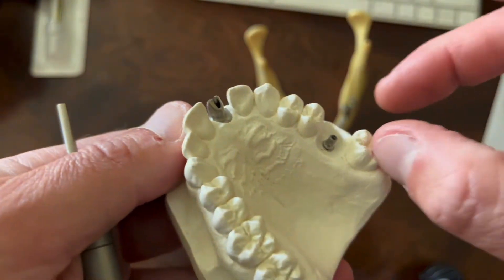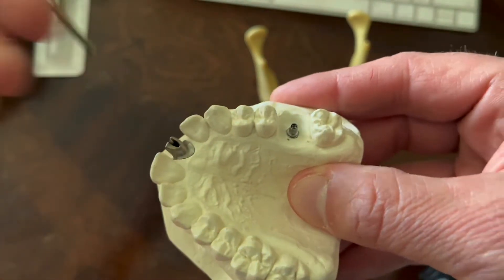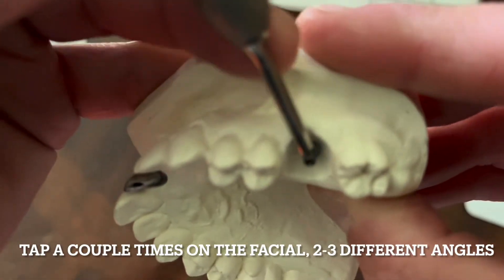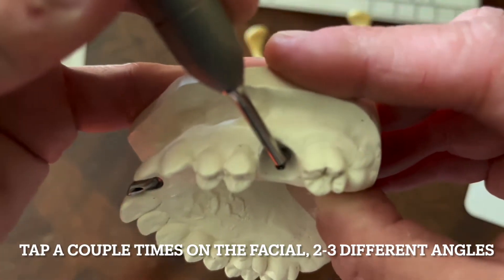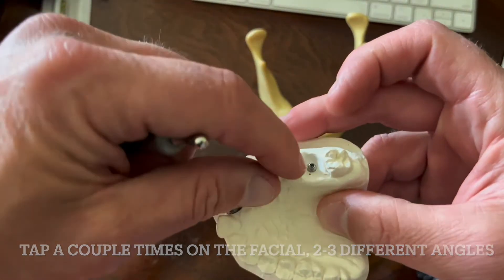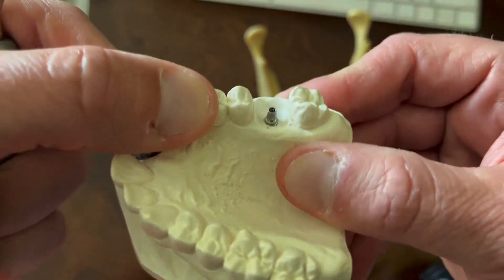But if I had a pair of forceps and was trying to grab and pull this abutment, I can't get it out. One of our methods was to place this on the facial of the abutment, then pull on the back of this thing, give it a couple taps, and that would break that cold-weld seal on a Morse taper with our abutment.